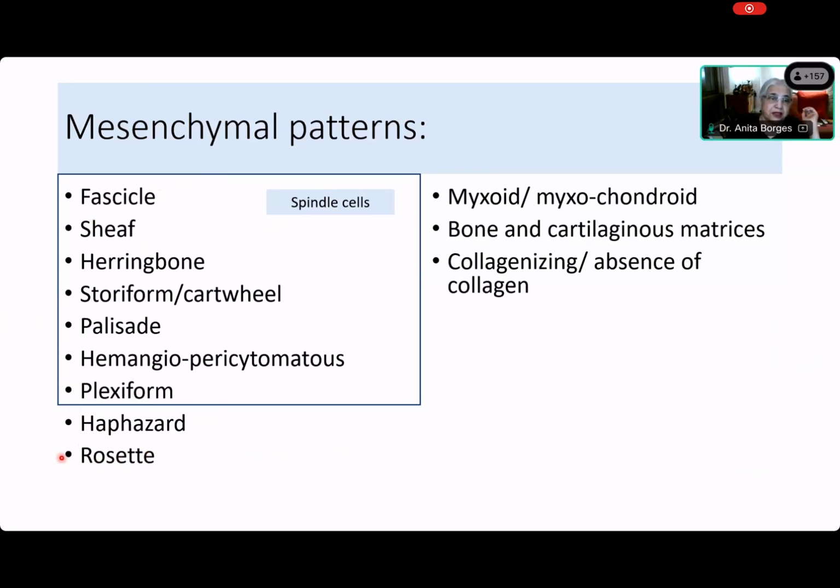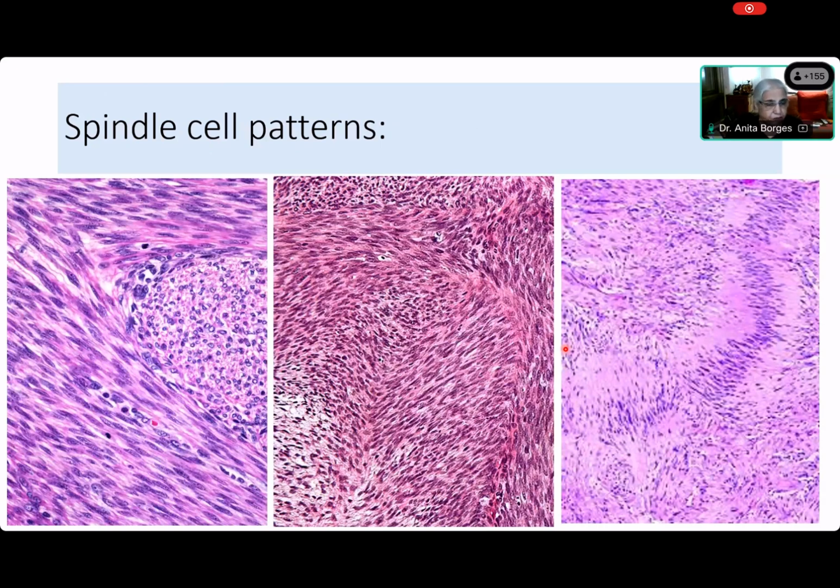Now, spindle cells by and large do not form rosettes. That is another mesenchymal pattern altogether. But spindle cells can also lie within a matrix, and that matrix may be myxoid, it may be myxochondroid. Sometimes you get spindle cells in bone and cartilaginous matrices. It's not very common. The most common matrix in which you see a spindle cell is collagen, or the spindle cells may be so closely packed that you can hardly see any collagen or any other matrix at all. So now we need to know what these different patterns are, so let's talk about them.